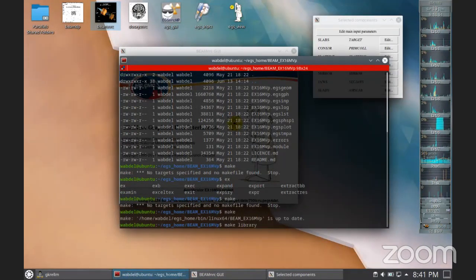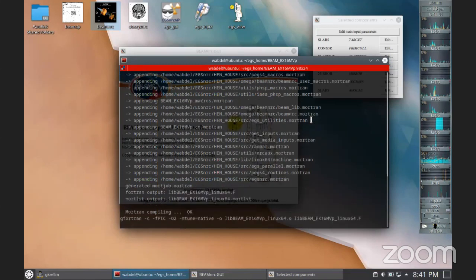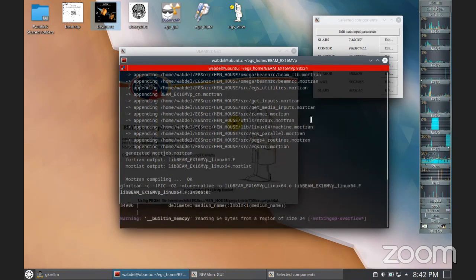Make library. This is another source you could use. For example, there might be a limit to how big the phase space file can be, or you probably just don't want to do any phase space file simulations. There is a way you can take the beam model with a certain input as a source for the dosxyz calculations, and I'm going to show you both.